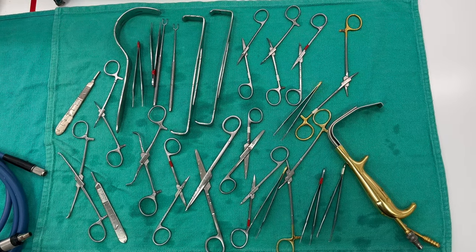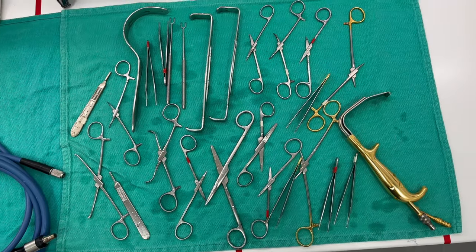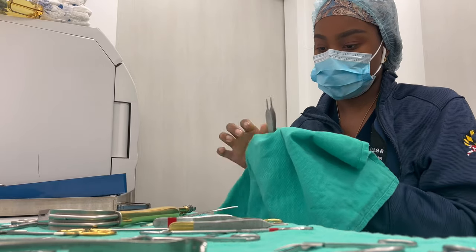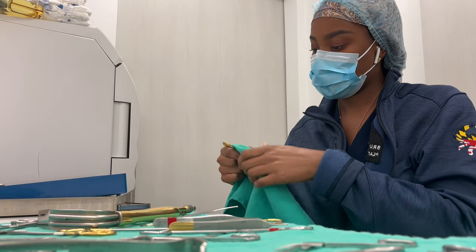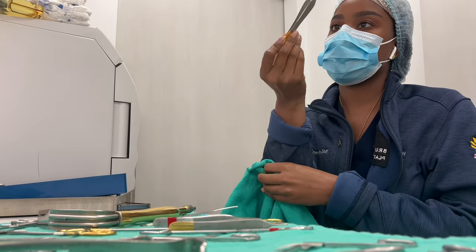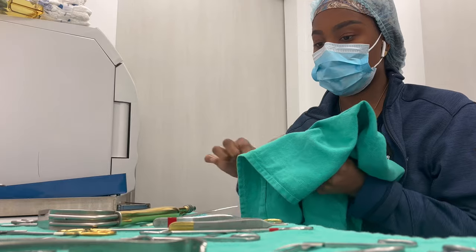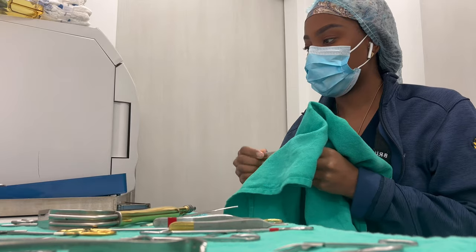If I'm behind schedule, or I need to reprocess a tray for the next case and I don't have time, I'll grab another fresh green towel and pat them dry like I'm doing here. I wasn't really in a rush, but I wanted to go home on time. Doing this also cleans them a little bit more. Sometimes they'll have watermarks on them, and I like to make sure that's not there. If there's any residual water residue, the towel helps take it off. So that's what I'm doing here to get all of them ready to be re-sterilized.